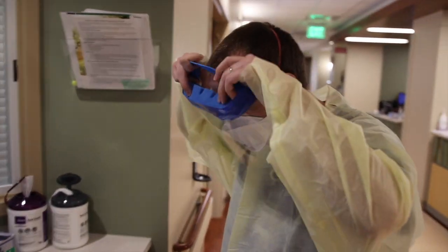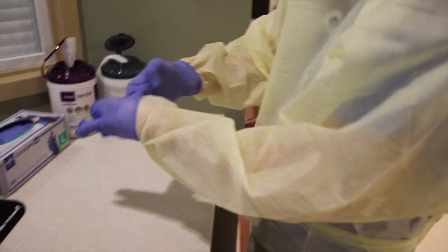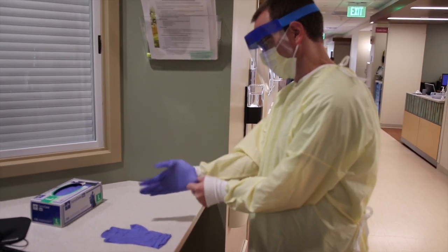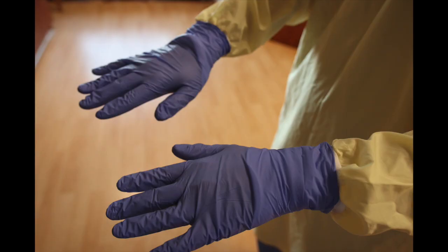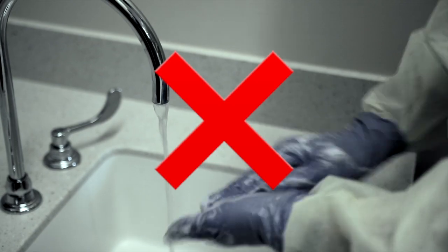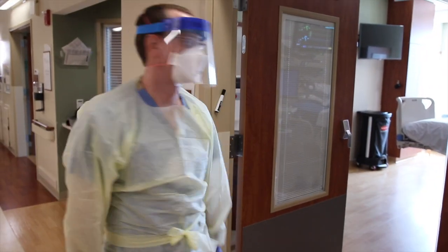Put your face shield on over the N95, then put on your gloves. If you are using a reusable gown, pull the elastic part of the gown forward covering the base of your hand, then pull the gloves over the top of the elastic part until they are covering it completely. And just as before, do not wash gloved hands at any point in this N95 protocol. Grab any equipment you may need and enter the patient room.